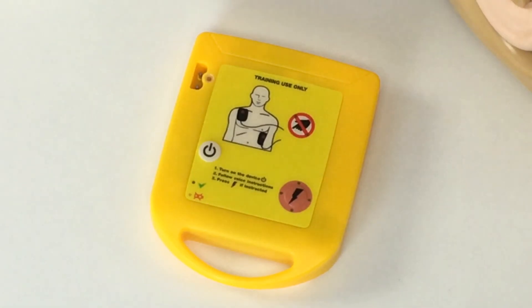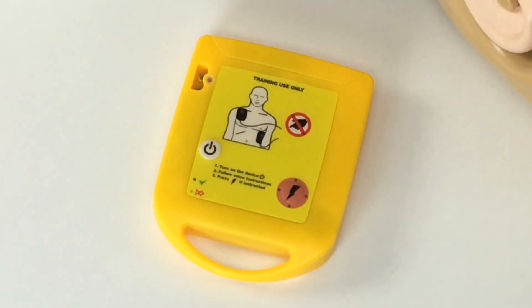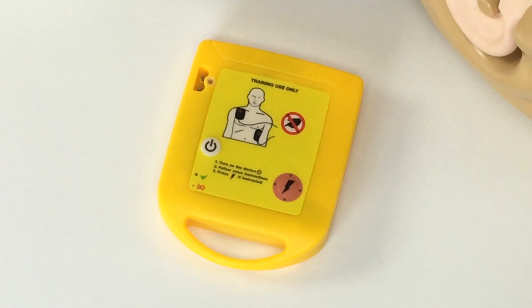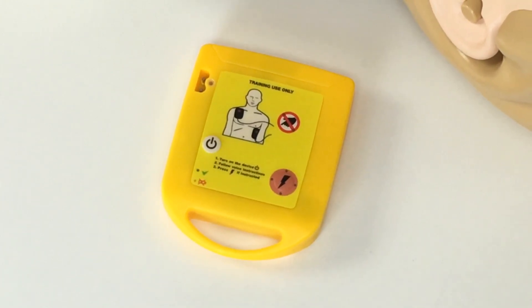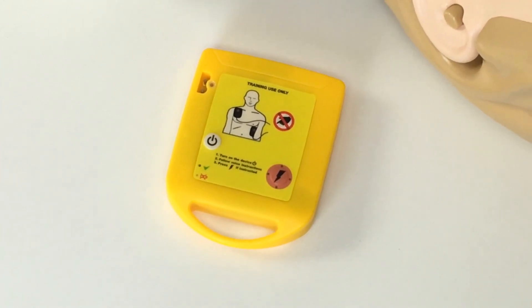Now let's have a look at the Mini AED Trainer itself. The vast majority of semi-automatic AEDs on the market have two main functions: an on-off switch and a shock button. A few models need the pads plugging in, and most have visual indicators too. The Mini AED Trainer has all these functions, so don't be put off by its size.